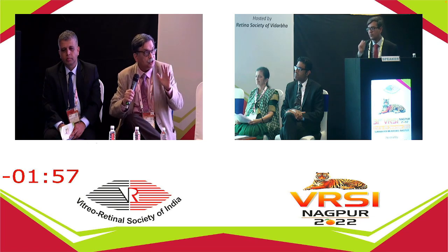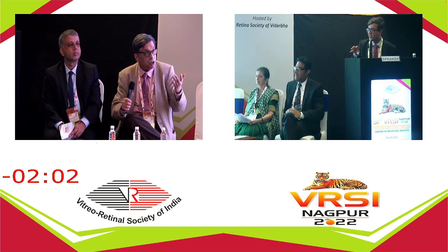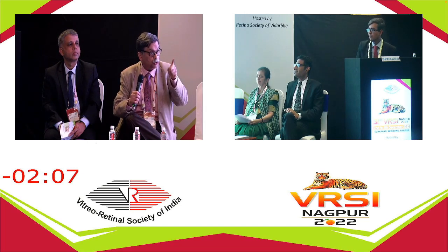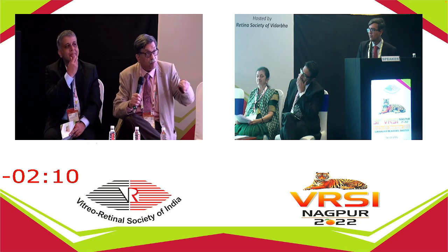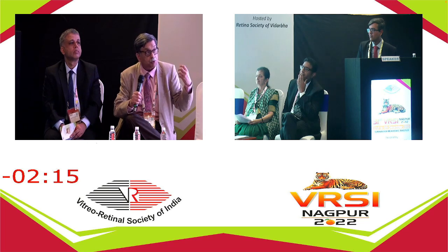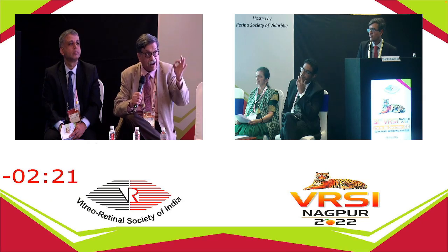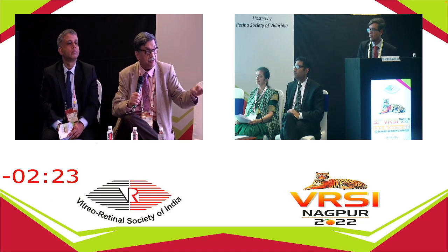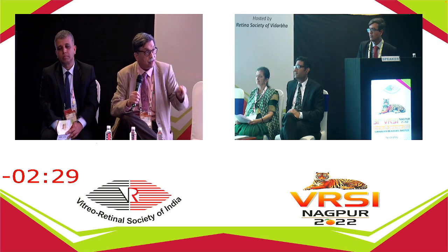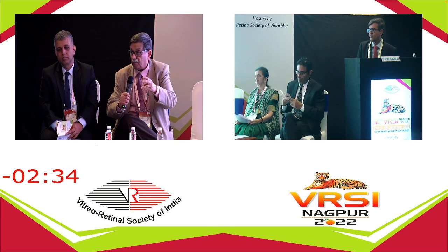So let's not confuse the two. Yeah, both are similar lasers. This is only to prevent the collateral damage, so that what we are doing is localized and focused. But that will be better with the argon laser, because when you're using the diode, part of that dye is roaming around within the entire retinal architecture, so part of it is absorbing the heat. It's much better if you use an argon laser, because only the area where the RPE is getting heated up is treated. Where you're using a diode with ICG, the ICG has gone into the retinal architecture and will also absorb the heat. You have a less clear-cut margin than you would with an argon laser.